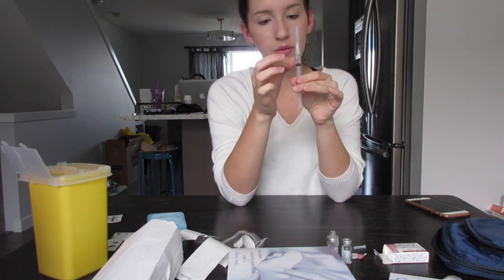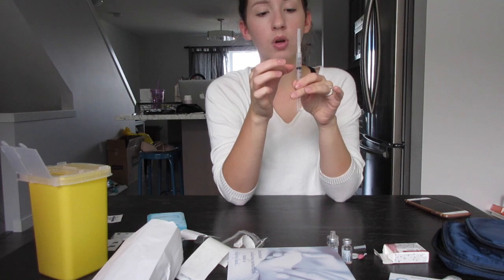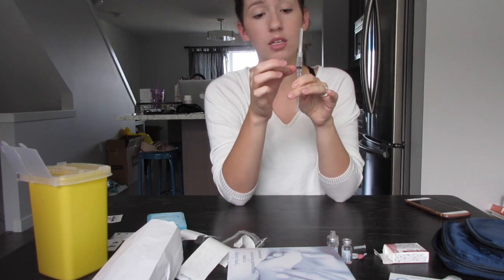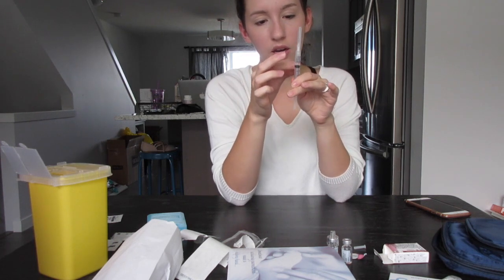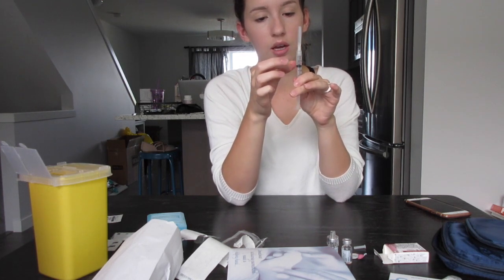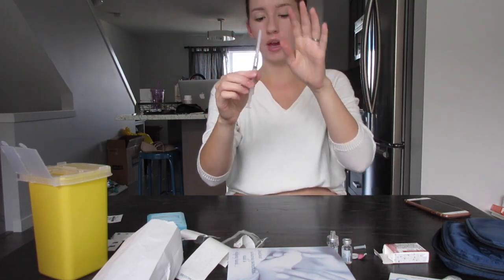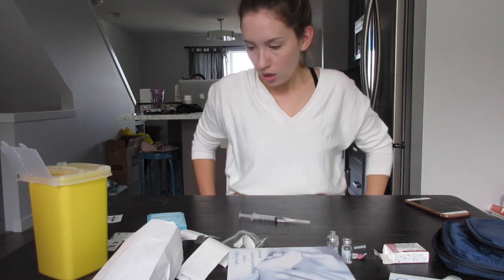I like to sometimes flick the needle to get the air bubbles out. Because you're doing it not in any veins, it doesn't actually matter if there's air, which is a sigh of relief. So just get out what you can, and if not, it's not actually an issue. So now this one is ready to go. We have the cap on that I will take off once I'm ready.